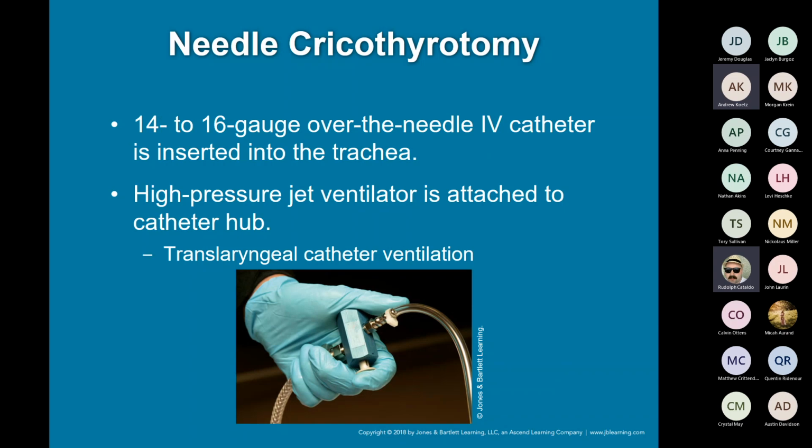Then we generally use a device like this, where his finger is a trigger. When it's time to breathe for the patient, he squeezes that trigger and it sends a short burst of air, a very high PSI burst of air to overcome the diameter of the needle. That's how they're able to breathe for the patient. I mean, sure, you could sit there and bag them. It's just not going to be effective. It's going to kind of suck a little bit, to be honest.